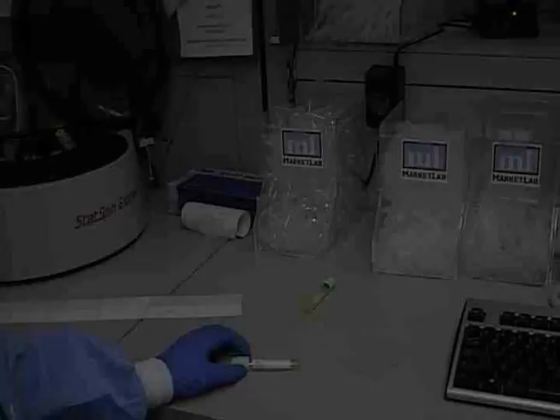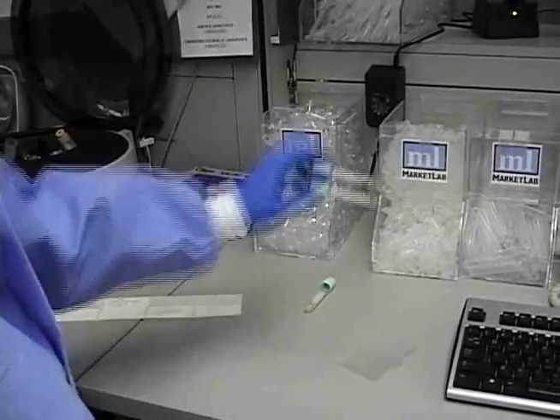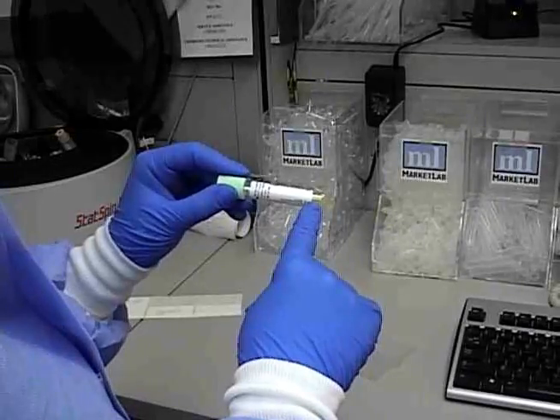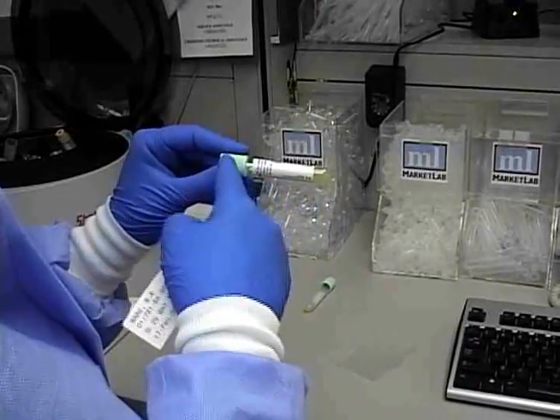Now, I'm going to show you my 3-step method to labeling tubes. Very simple. 1, 2, 3 steps, and you can be a pro like me. Step 1. Take the tube where the label is facing you and hold it so the opening is facing left.